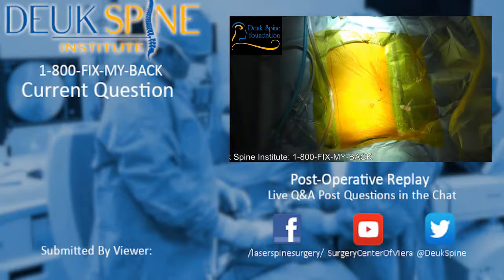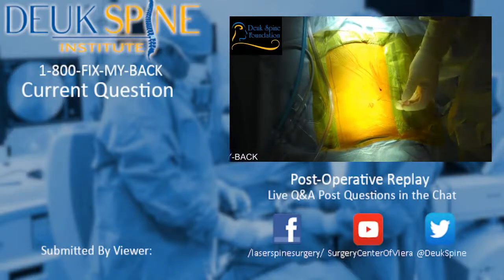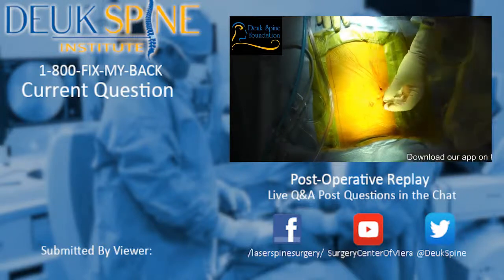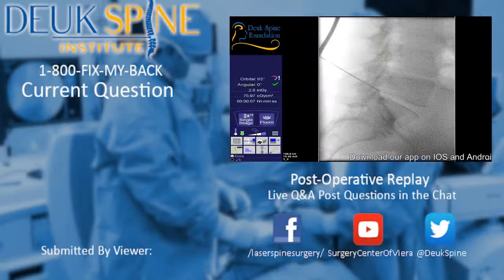The patient is a large man, a big guy, and that poses problems in and of itself, challenges in terms of getting to the disc. And then the disc herniations were really medial, meaning towards the center of the spine, midline, and that creates challenges because you have to start further lateral to get more medial. We did that, and I was able to do a lot. Question is, is it enough? And that we don't know until the patient heals from their surgery. So we'll know for sure in about 4 weeks.